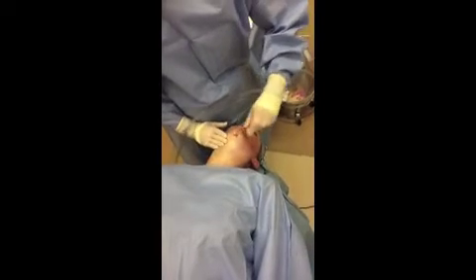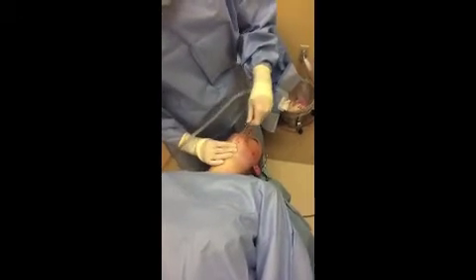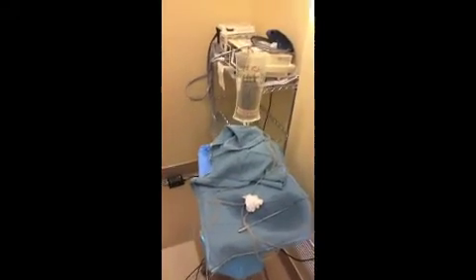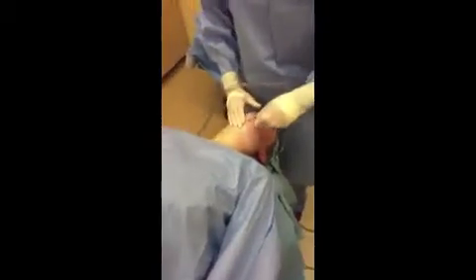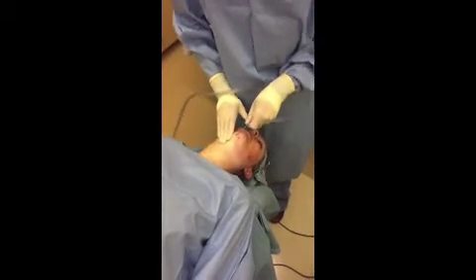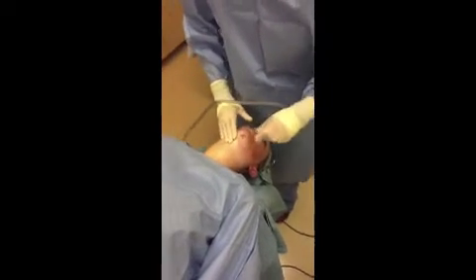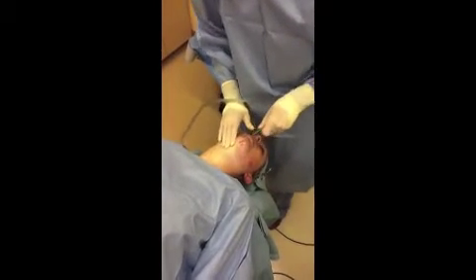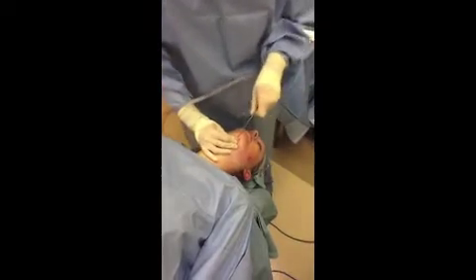So before doing the liposuction, we use these same little portholes and we infuse saline, which you can see over there, into the same areas. And it has lidocaine in it, so that it numbs up the whole area. Mary's just taken a little bit of Valium for this procedure, and is very comfortable, as you can see.